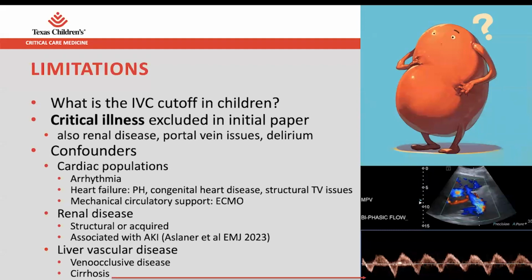And I think really the reason for the IVC cutoff is just to exclude the population of people who happen to have weird signals, honestly, because it's just a means of at least getting into the ballpark of patients who are more sick than not.